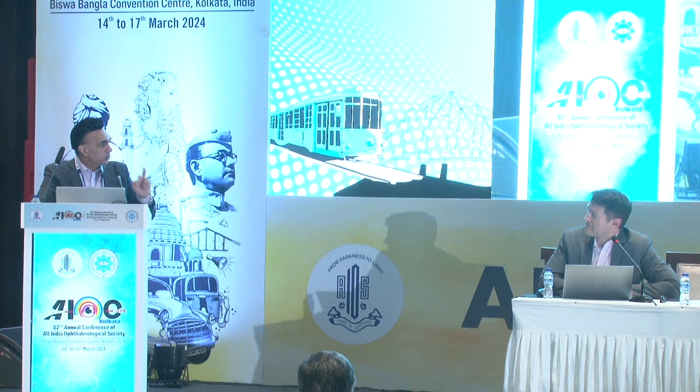which eye do you put the lens in, because currently the masks are the same size. So what I do is I will look at the basic topography and see which eye has got the more irregular cornea, and that's the eye I basically go for. I put the IC8 in, and then the other eye I just use a monofocal, and that seems to work quite well. Because you've got that depth of focus with the pinhole optics, it gives you a little bit more leeway with the accurate biometry, because that can obviously be very challenging, especially as we mentioned in irregular corneas, to actually calculate an accurate biometry.